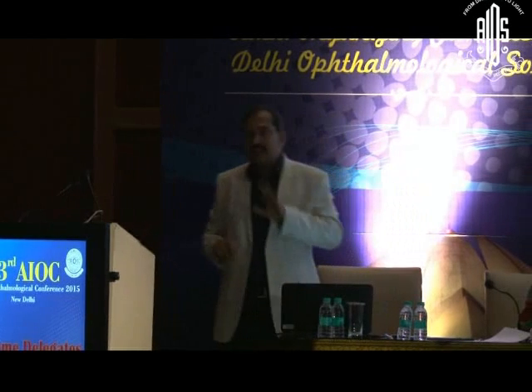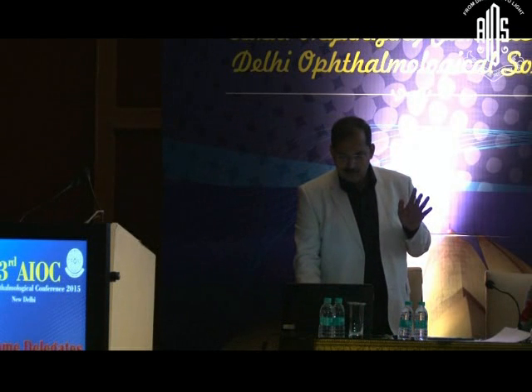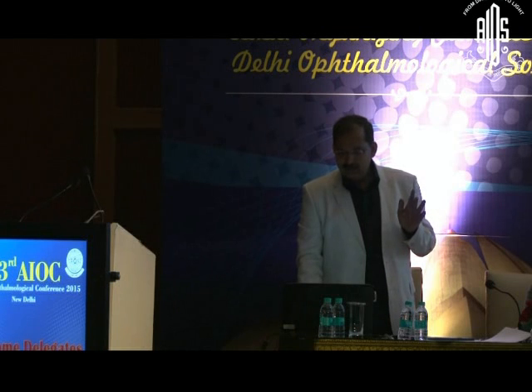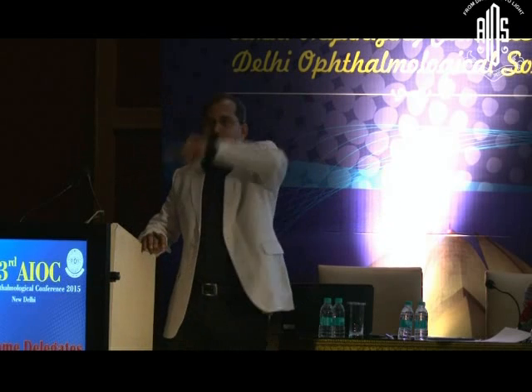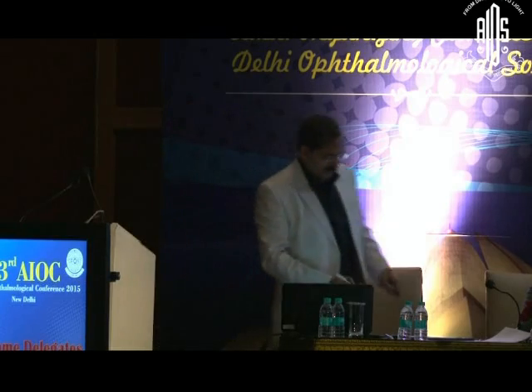Okay. Next is the astigmatic dial. Has anybody seen it? You can make it yourself. You can just go to a paint program and make an astigmatic dial and use it. Basically it has the hours of a clock, only in the upper part, not the full circle. It's just a dial, like this, clock hours.